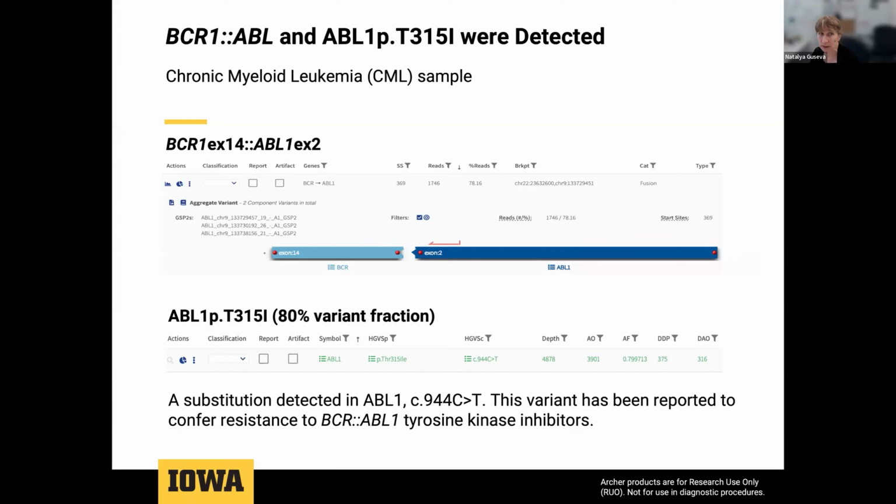So also you can detect that mutation by this method simultaneously with your fusion detection in one sample. It was also kind of important, and we see it not very often, but sometimes it could explain why these tumors behave this way.